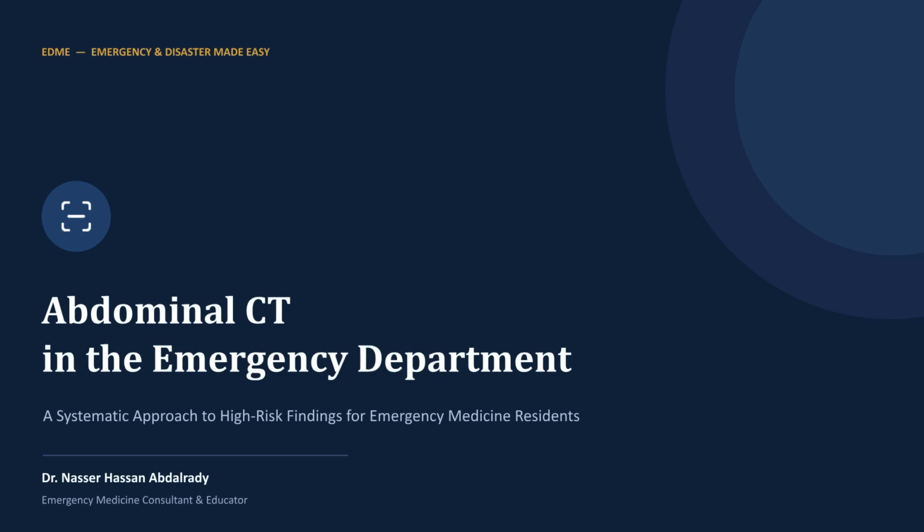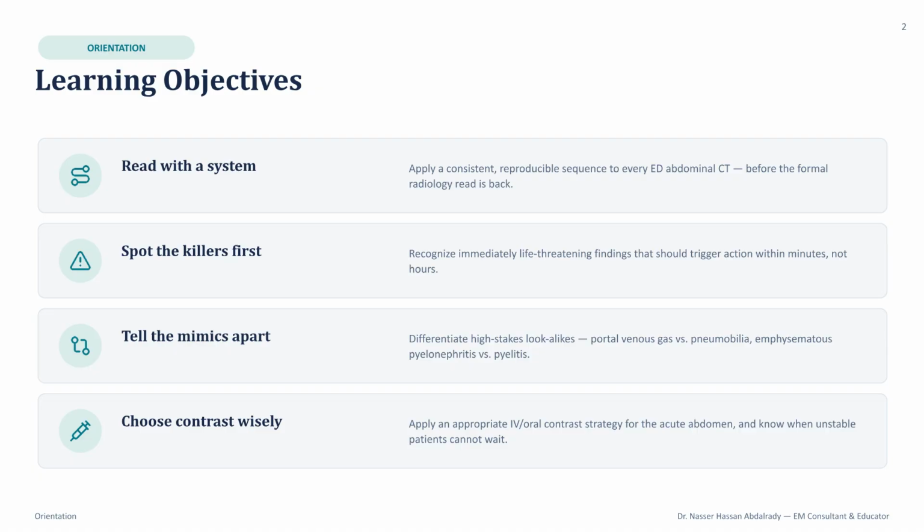Welcome to this video on approaching abdominal CT scans in the emergency department, designed to help emergency medicine residents recognize high-risk, life-threatening findings. Our learning objectives are to master a systematic reading approach, identify critical killer findings, distinguish between similar-looking conditions, and apply the correct contrast strategy for acute abdominal cases.